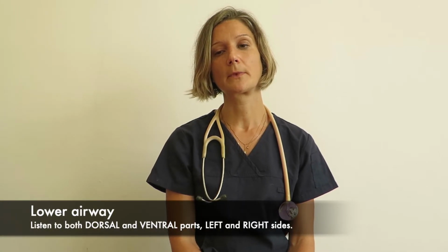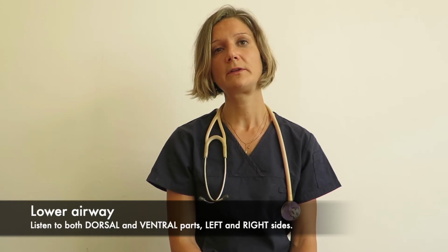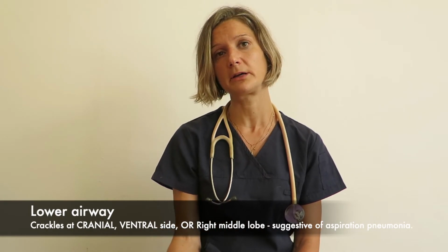So when you listen to the chest, you could listen to the ventral part of the chest or the dorsal part of the chest. When you hear some abnormality, it's quite important to make a mental note of the location, because if it's dorsal that you can hear crackles, then that's less likely going to be consistent with an aspiration pneumonia. If you hear crackles in the cranial part, so the ventral part of the lung lobes, that's more consistent with a possible aspiration pneumonia.